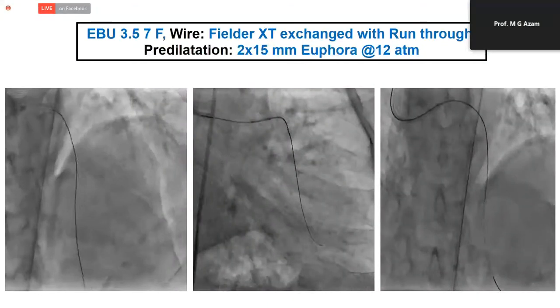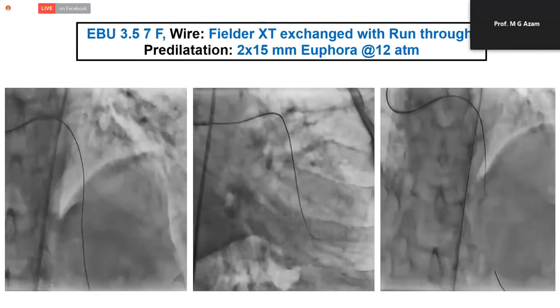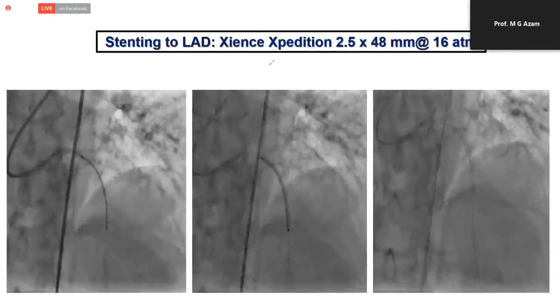We just approach with the Fielder XT. We just down the Fielder XT, exchange the microcatheter, and predilate with a 2x15 balloon. Then we go straight to stenting by deploying the drug eluting stent and post dilate, and this is our final result.